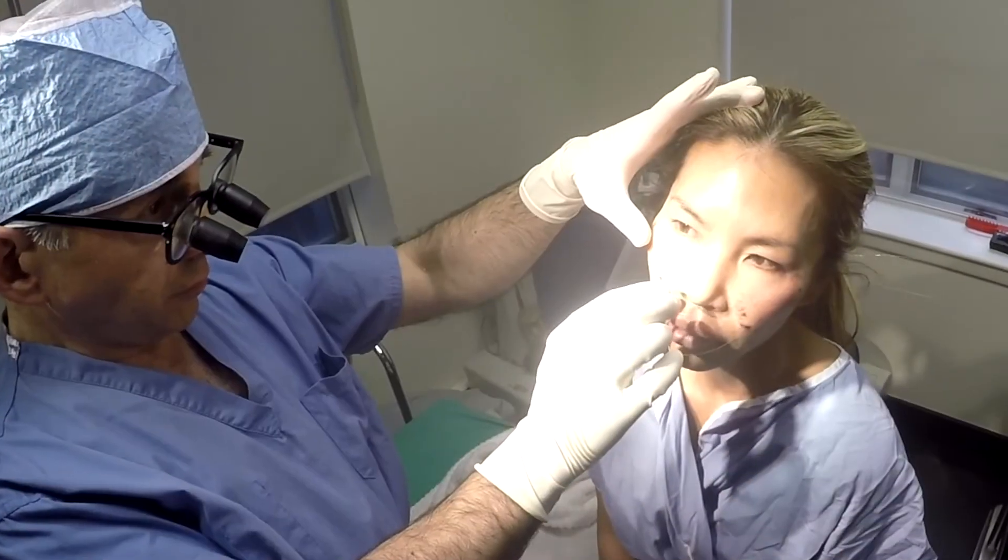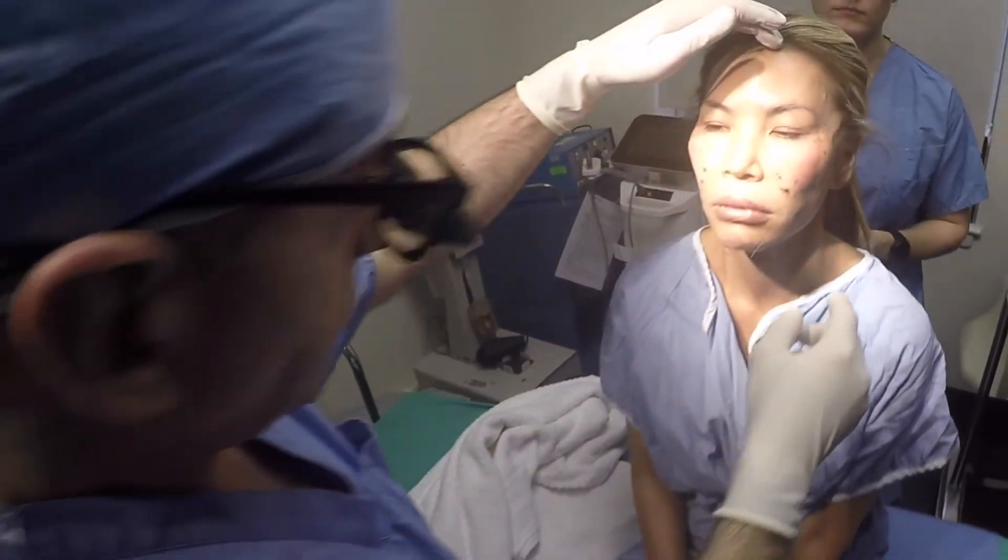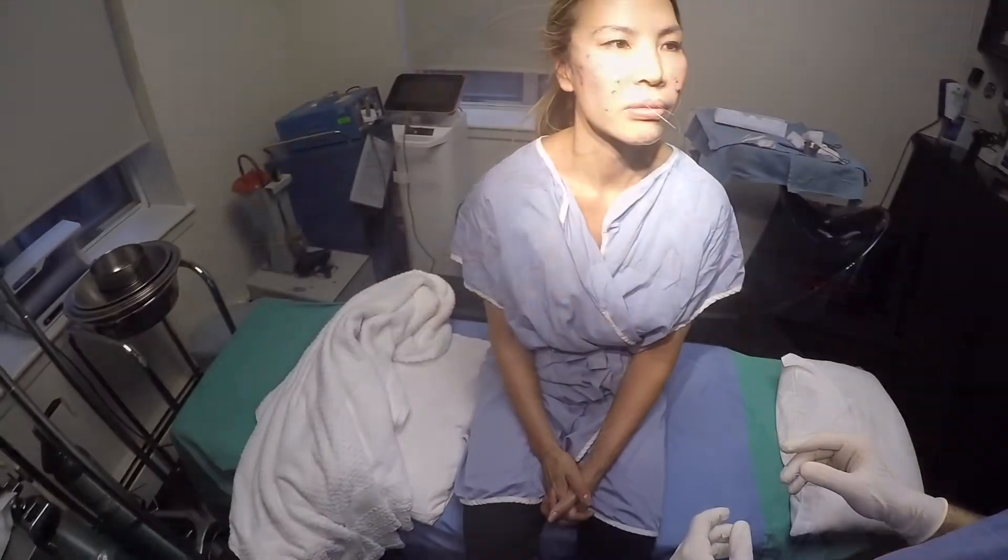The InstaLift procedure is done under local anesthesia, takes about an hour, and the effect lasts in the range of 12 to 18 months.